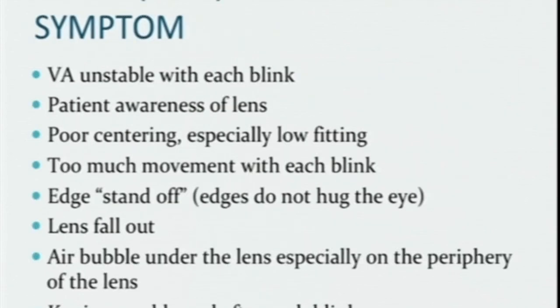The signs and symptoms I already mentioned. Visual acuity is unstable with each blink. Patient awareness of the lens, the foreign body sensation might be there. And because of the poor centering, there will be low fitting and the lens might move to one place.